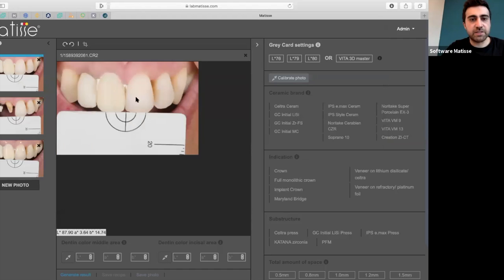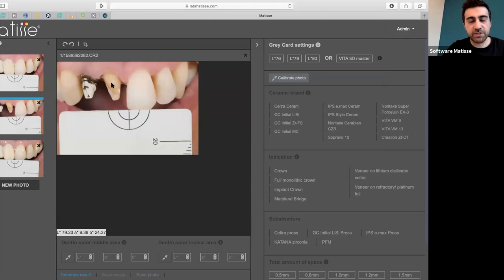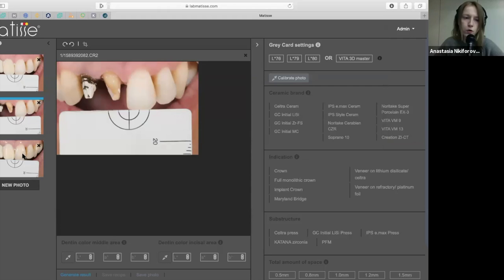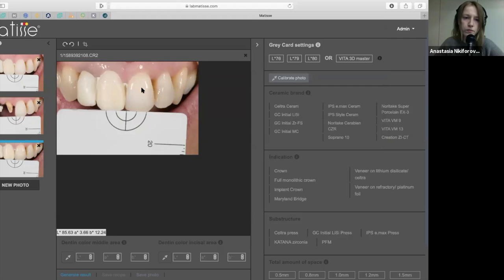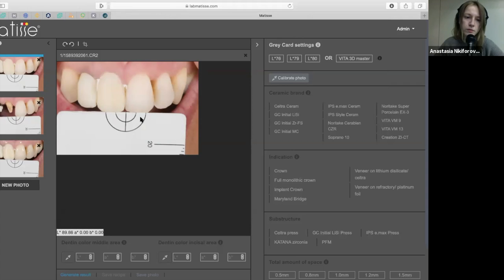So the first picture is to measure the dentin colors. The second one is to measure the prep color. And the third one is to see what enamel to use. So we have to calibrate all the images to be able to measure the real color of the tooth.